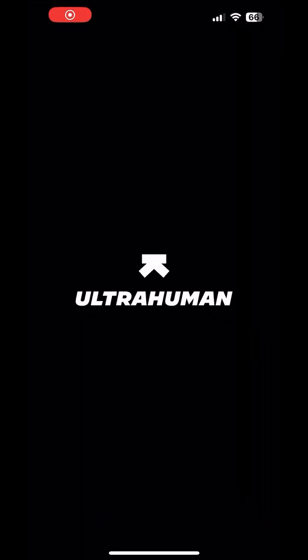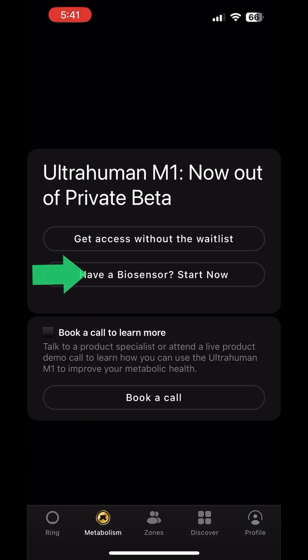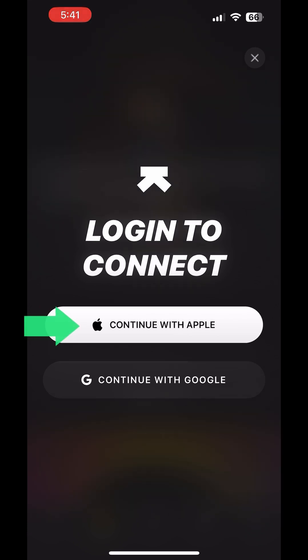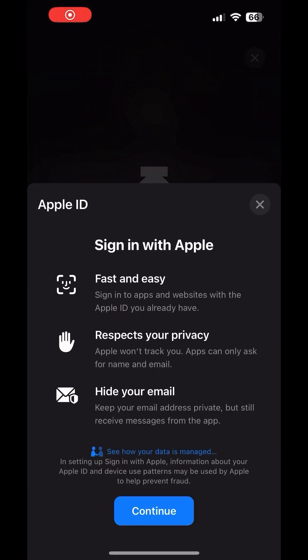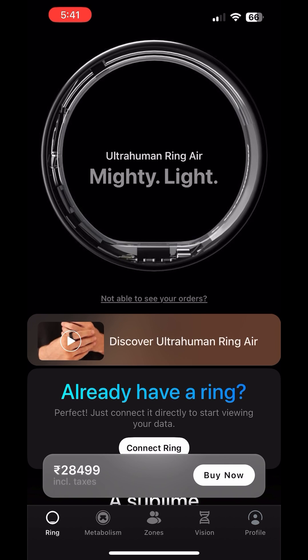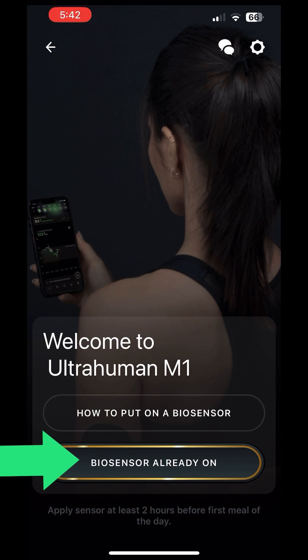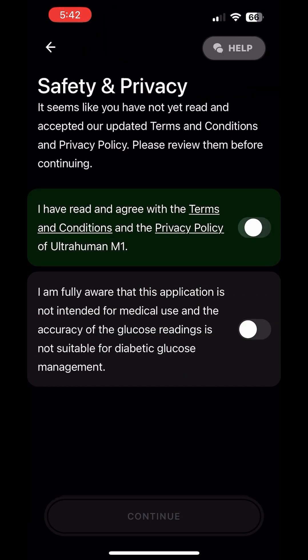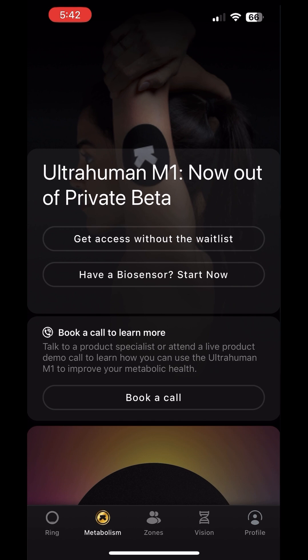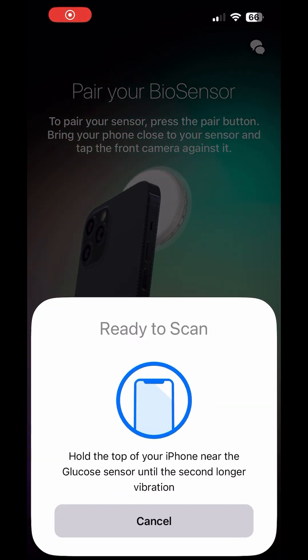Open the Ultrahuman app and click on the metabolism section at the bottom. Then select 'Have a bio sensor', then 'Start now', and continue with Apple. After signing in, you will see an option for bio sensor. Accept the terms and conditions to continue. You will get an option to pair your bio sensor — click on it to pair.